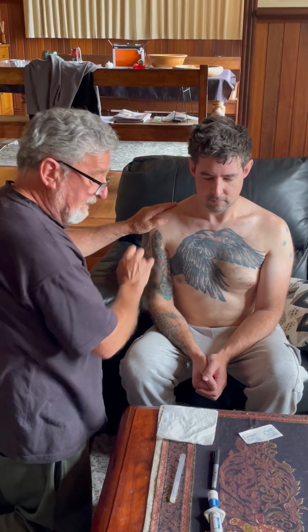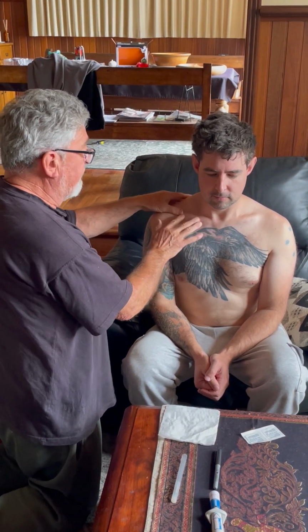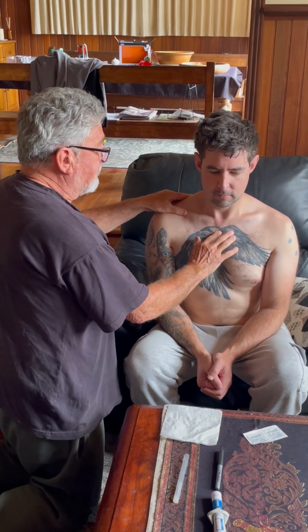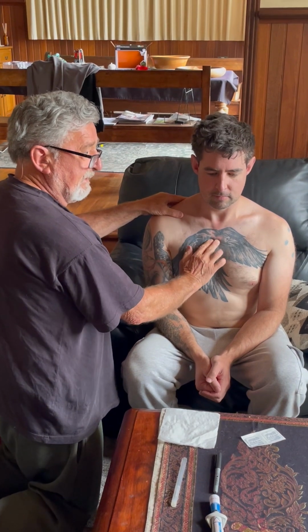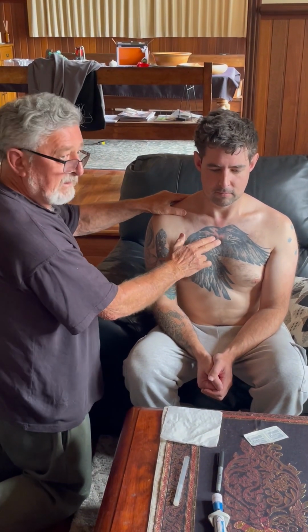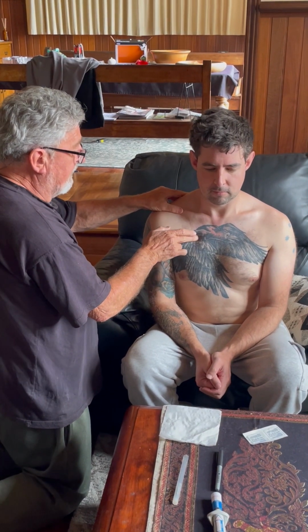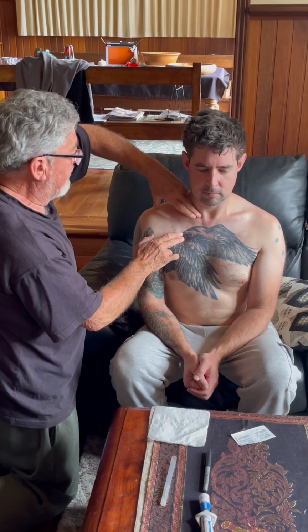Okay, so we're going to look at the landmark there. The landmark we're looking for is the second intercostal space, mid-clavicular. We go down from the suprasternal notch, down the sternum until we find the first bump, this notch just below the suprasternal notch. That's called the angle of Louis. Okay, we run our fingers across, and that's the second intercostal space just there, and we're looking at mid-clavicular.